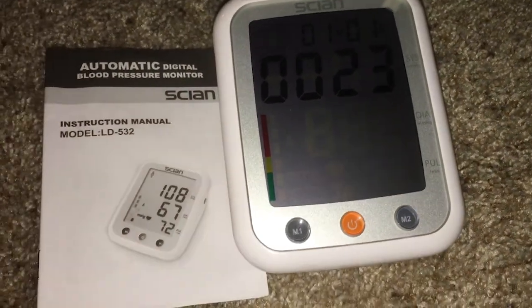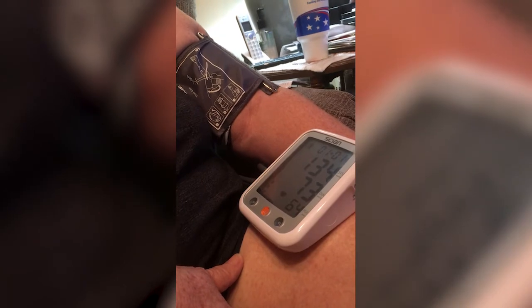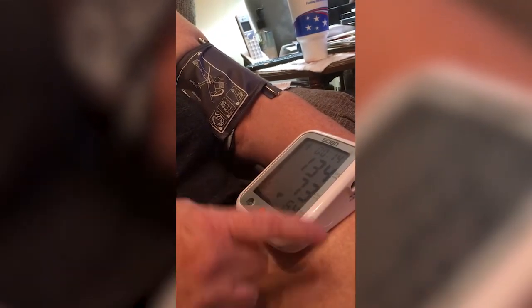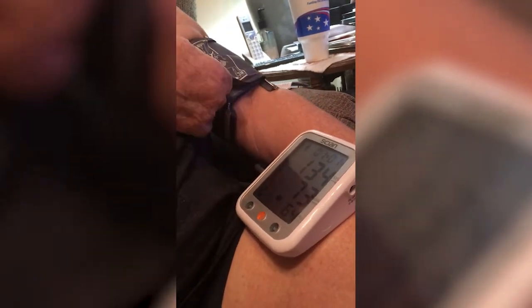Be sure to stay very still and do not talk. My grandmother really enjoys this product. She said it's easier than her old one, which has a smaller screen and is harder to read. This one, she said, is easier to read and easier to use because of the bigger screen and the brighter screen.